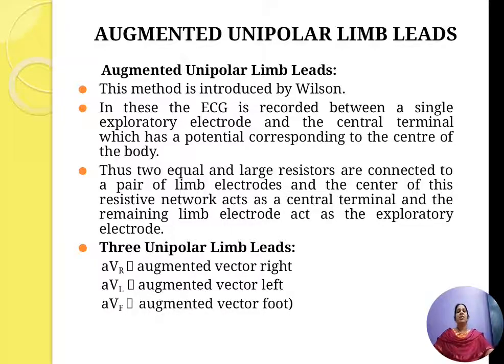You are considering two of the limb electrodes.